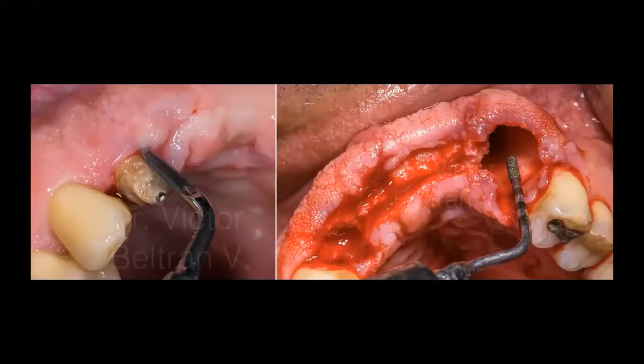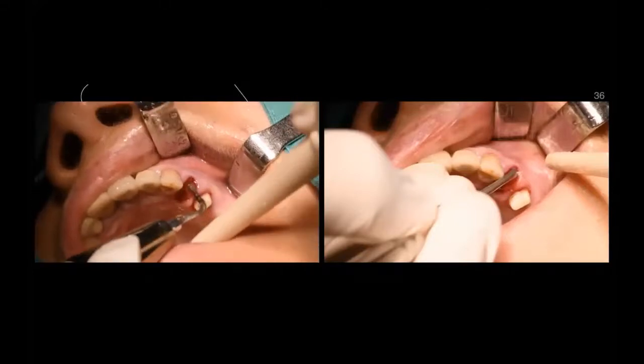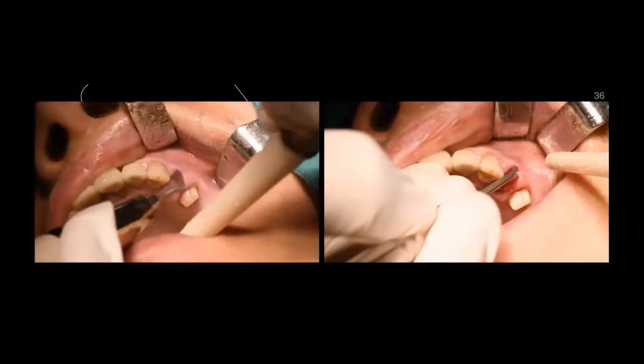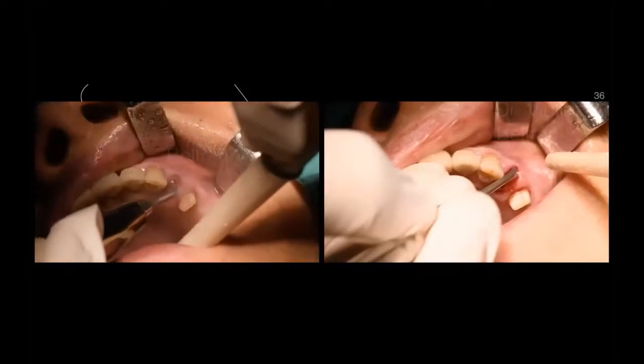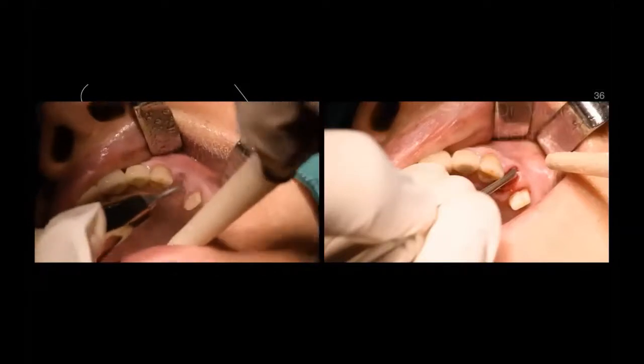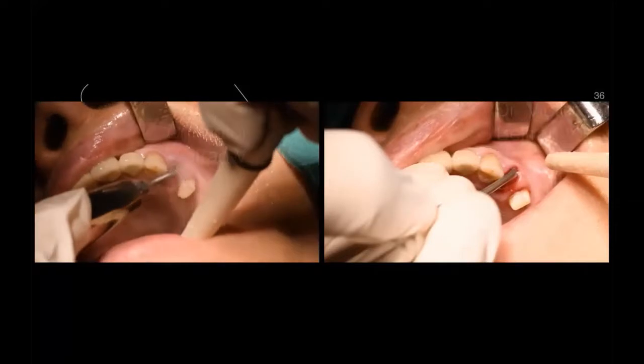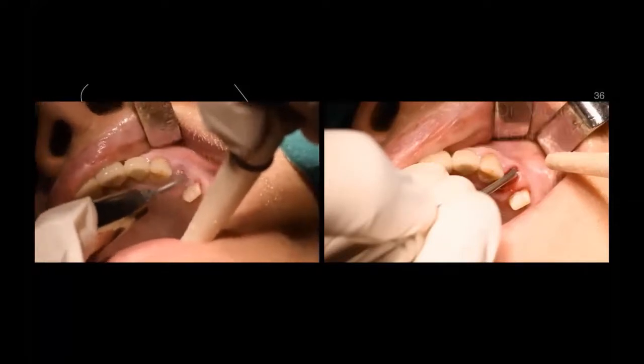an apical lesion. In this clinical case, after the extraction of the tooth in the 2.4 position, I am performing the alveolar curettage with the same piezosurgical cylindrical and diamond tips. I go through the apical portion of the alveolus, touching the bone wall. After that, I perform mucoperiosteal tunneling using pressure decollators.